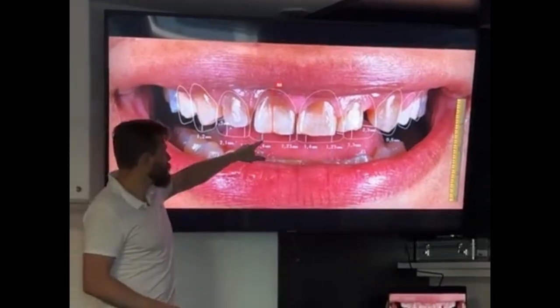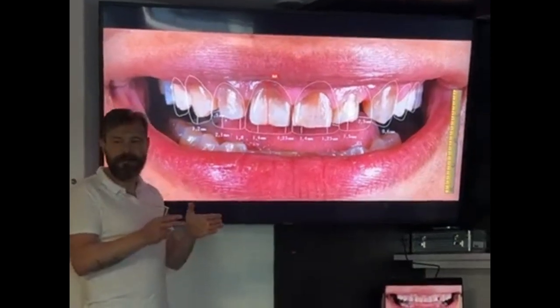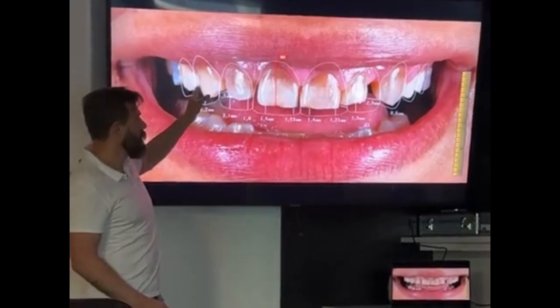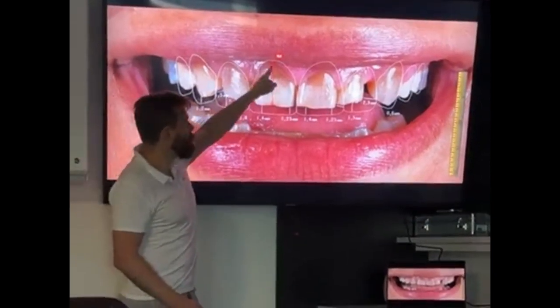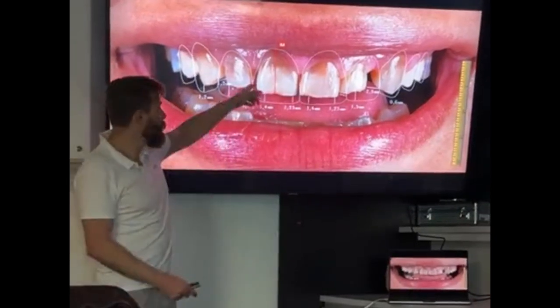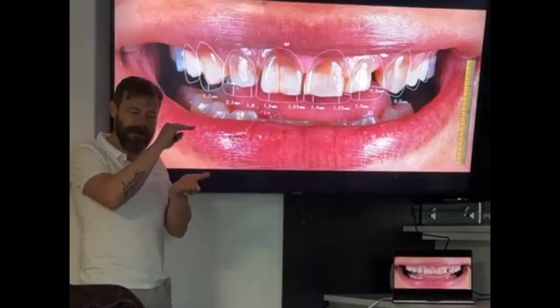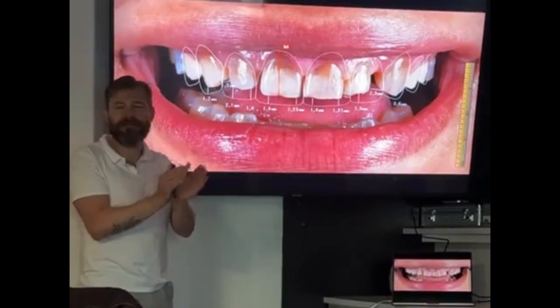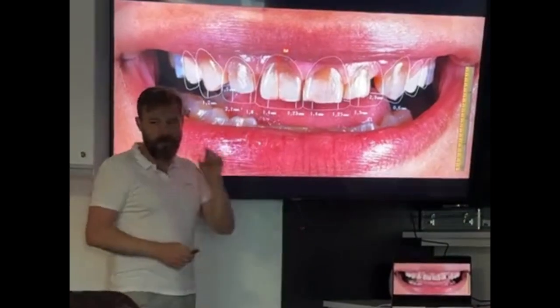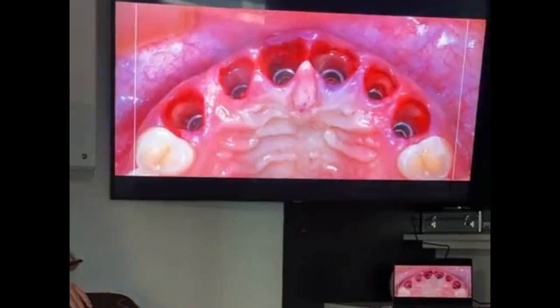So we're going to increase not just the incisal edge, we're going to increase the width of this crown, being able to close the diastemas here, and we're going to try to push the gingival margin a little bit to achieve a width-to-length proportion for this crown close to 80%. It's still going to be a little bit square-shaped for these crowns, because you have long diastemas to close in this case, right?